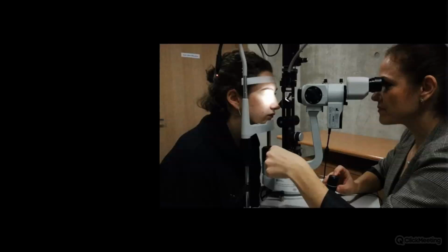Okay, I explain what kind of contact lenses. For the right eye I use Eye Optics, and for the left eye it was Johnson and Johnson Acuvue Oasys. Both contact lenses were toric contact lenses. Therefore, the diameter was equal, 14.5, but the base curve of the contact lenses differs. From my viewpoint, it's better to use the lens that is more or less movable.